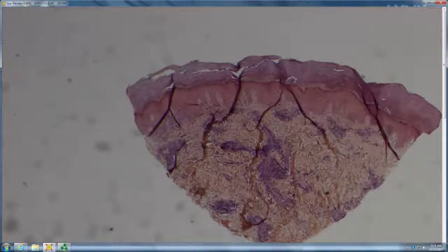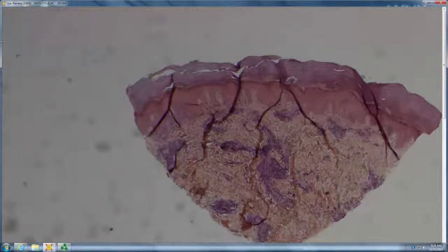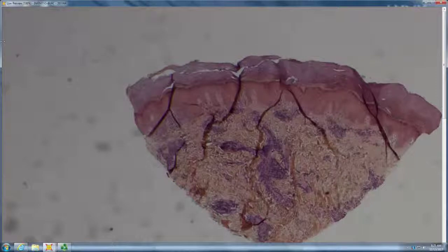That means it could be some drug reaction, or syphilis, or the other thing that's superficial and deep, polymorphous with eosinophils and lots of endothelial swelling: PLEVA. And arthropod bug bite is the other big one in that category.